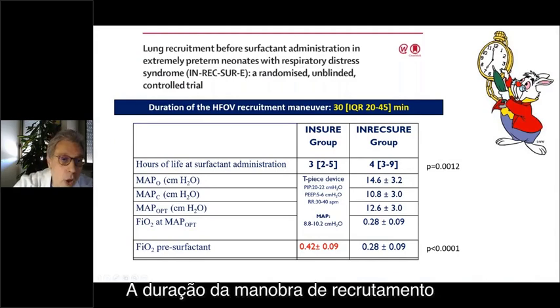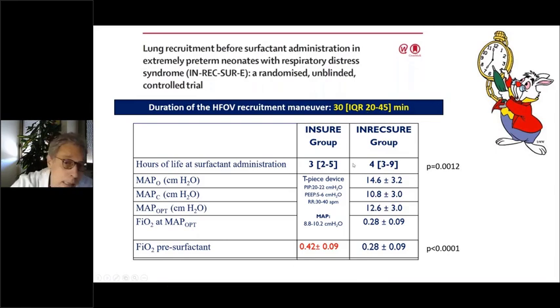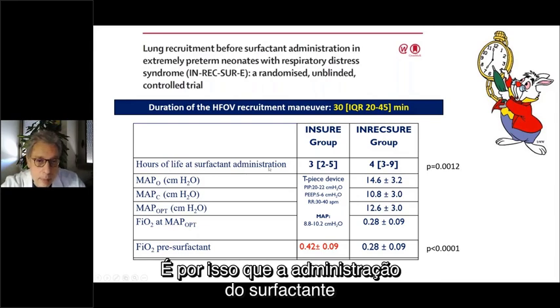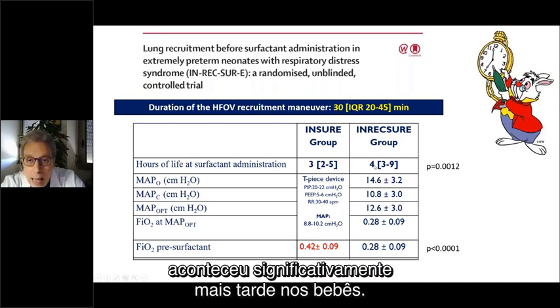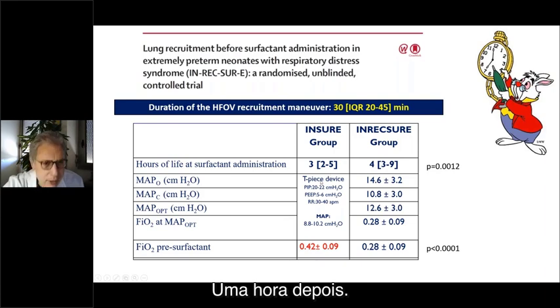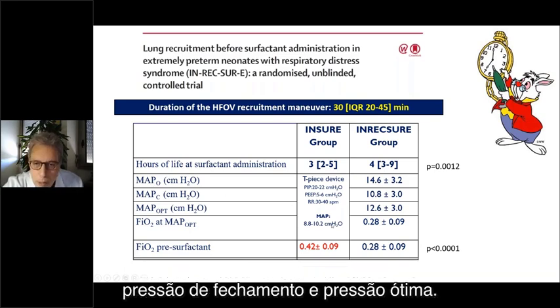The duration of the recruitment maneuver was 30 minutes, ranging from 20 to 45 minutes. And this is why the surfactant administration happened significantly later in the babies, 1 hour later. And these represent the mean values of opening pressure, closing pressure, and optimal pressure.